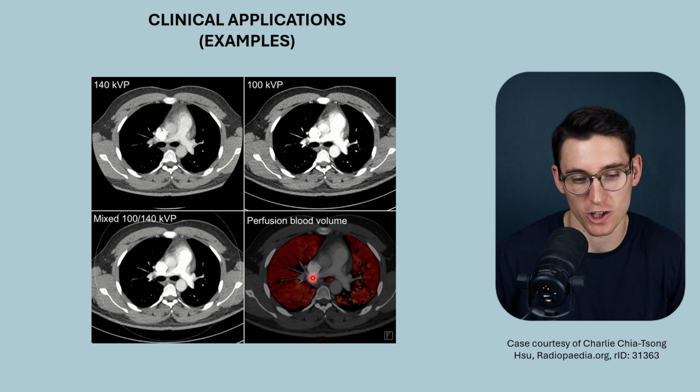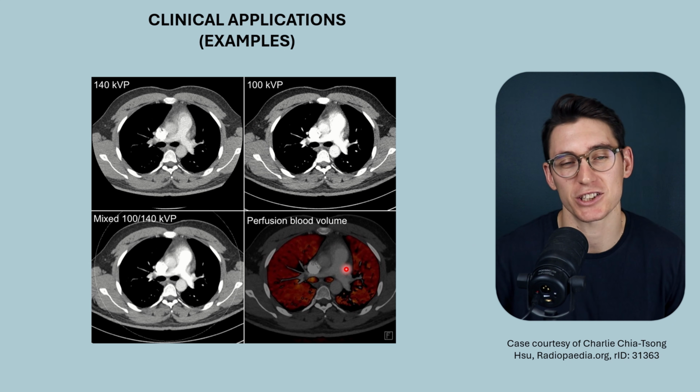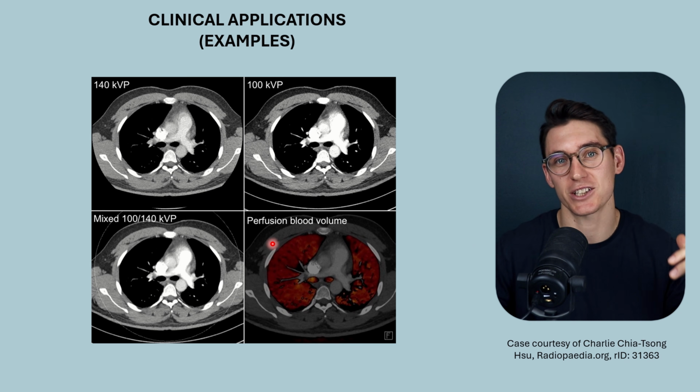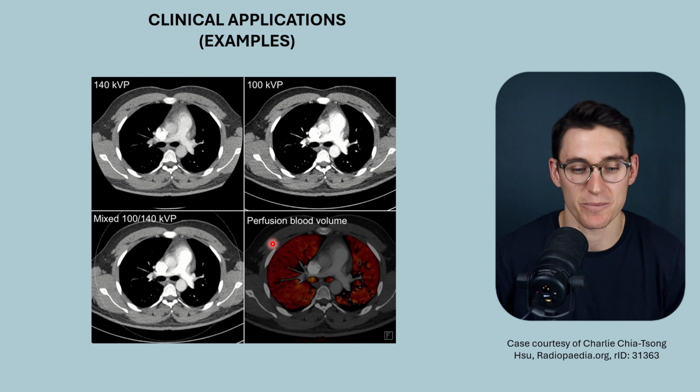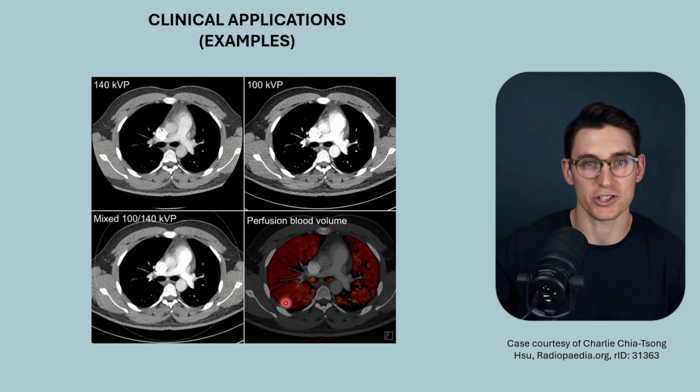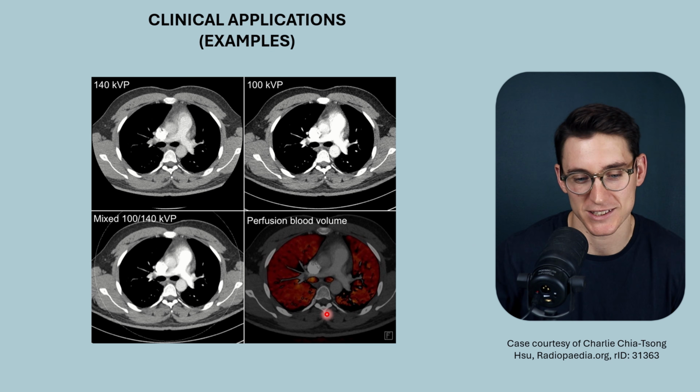This is a similar example, but we color-coded the concentration of iodine. Because we know the response of differing concentrations of iodine to increasing incident photon energies, we can then provide color maps. This has got a scale from orange to red, but it can be from green to blue, you may see as well. And we've got typical changes here.